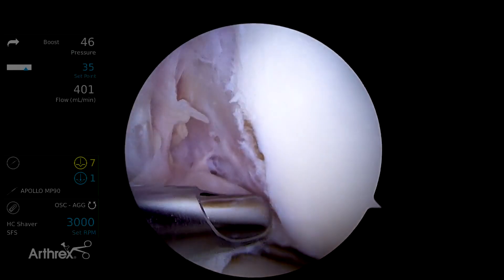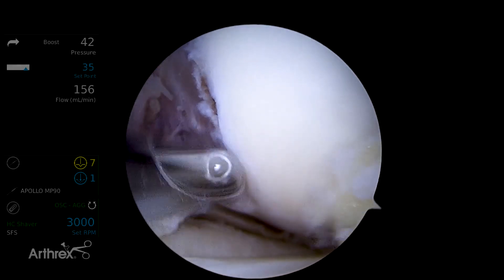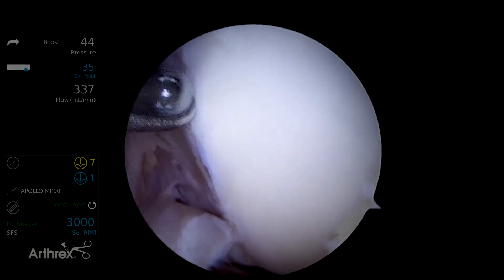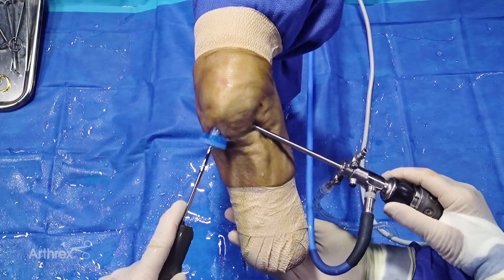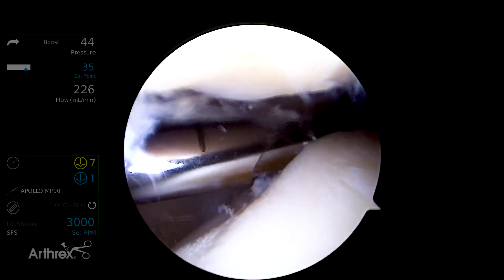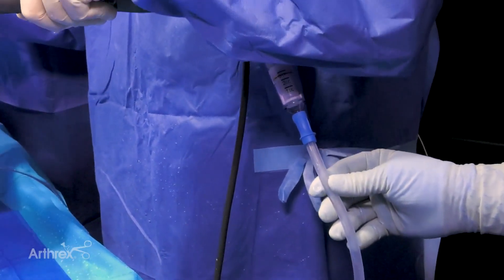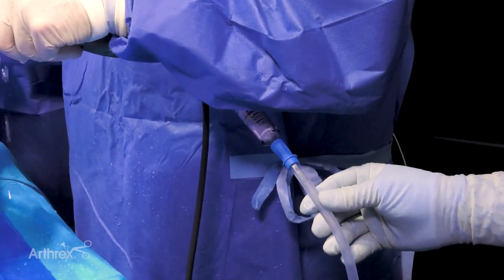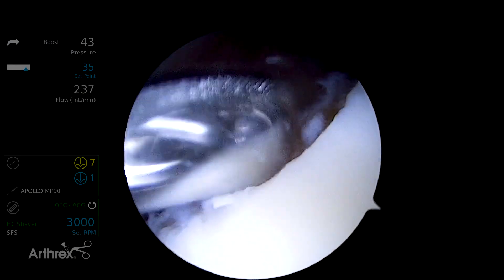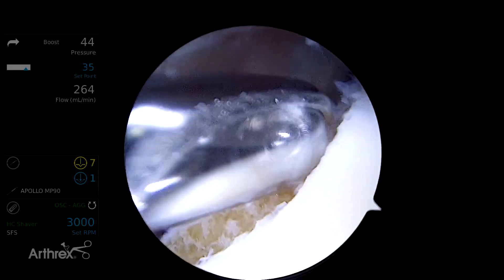One way to do this is to start from the intercondylar notch on oscillate and get it right from the edge. There's another area that's also easy — we'll put the knee in extension to access this non-weight-bearing edge. Again, it's really easier in terms of fragment size on oscillate. We're working off the far edge, trying to minimize the amount of bone. If you need a bone graft for an ACL tunnel revision, a concomitant osteotomy, a patella defect, or tibial tuberosity grafting, this is a great way to get graft from non-weight-bearing areas.